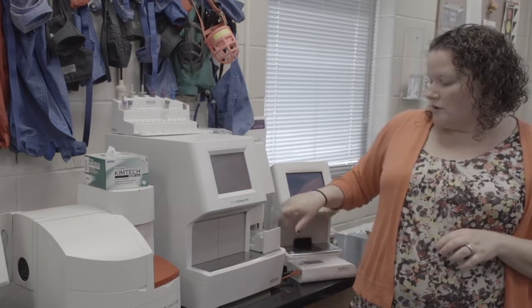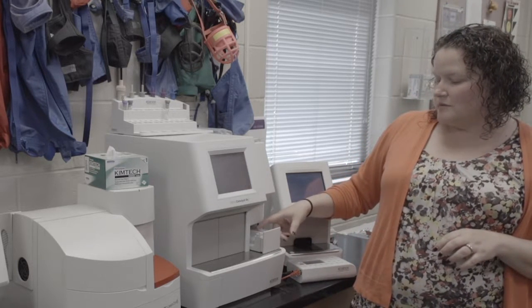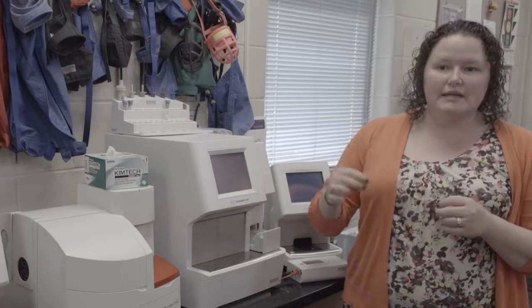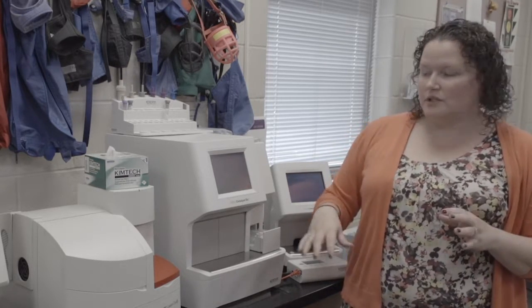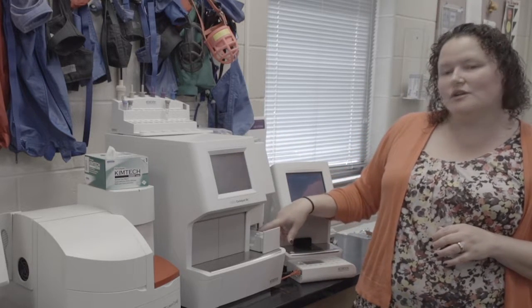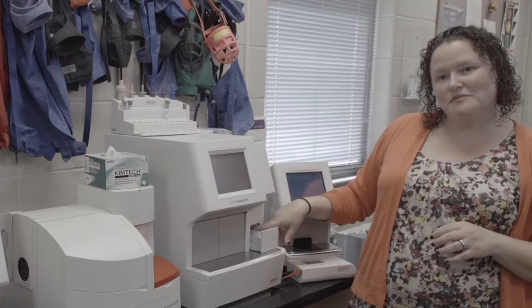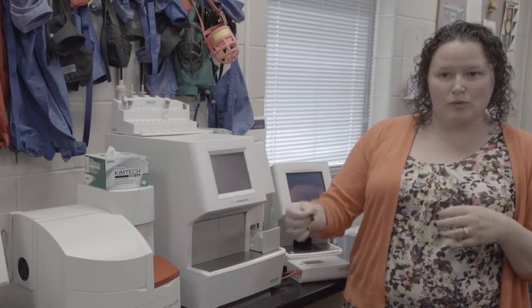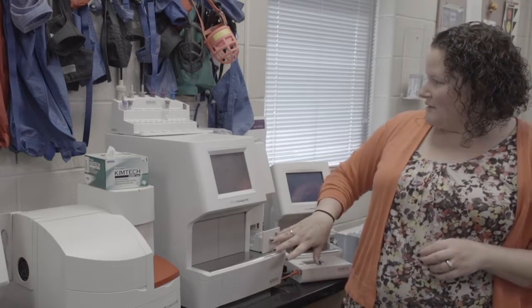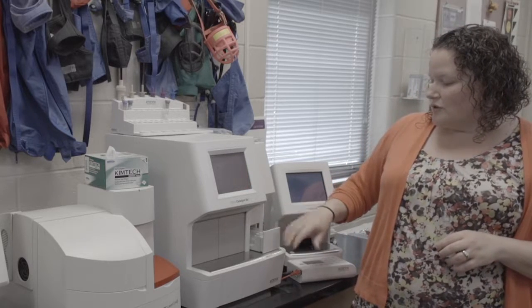So in this drawer is where your tips live. I don't know if some of you are familiar with our old analyzer, the vet test, where you had to add a tip and the slides individually with each run. The nice thing about this analyzer is it houses 12 tips for you. It's on a Pez dispenser type spring, so if you add so many, it looks full, you can push it back and add more. Hopefully you guys know what Pez dispensers are. Okay. I don't want to date myself there. So once it's full, then you would just close the door.